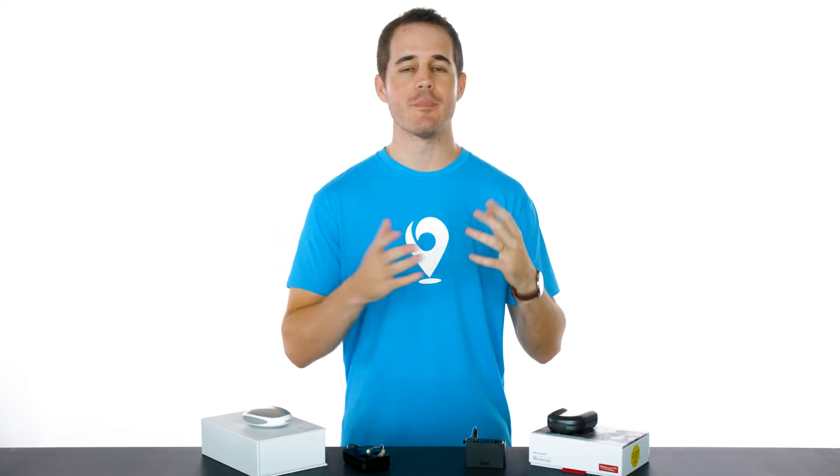People are always surprised to hear that most hearing aid batteries only last about a week. They're pretty easy to change — most hearing aids will give you an alert, like a voice saying 'battery' or a ding, so you know it's time to change it. You just open the battery door, put a new battery in, and you're set for a week.